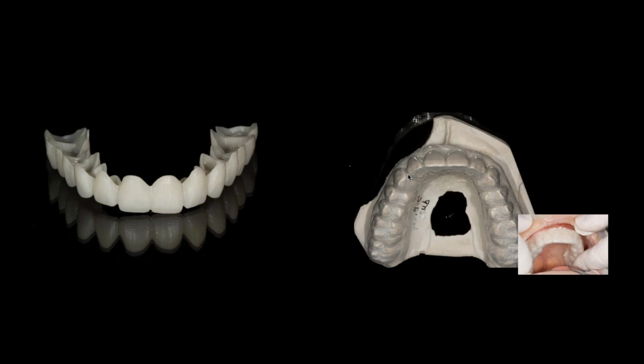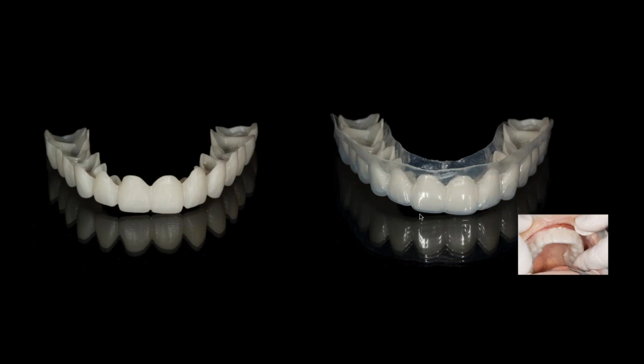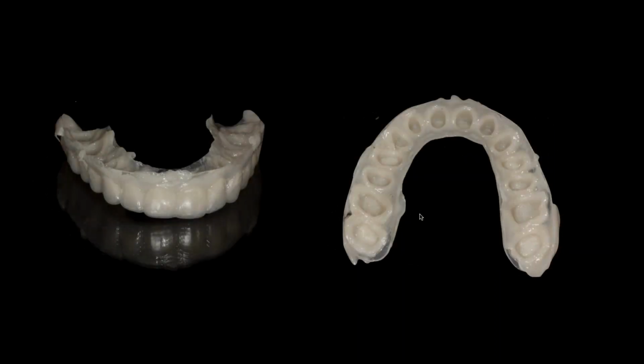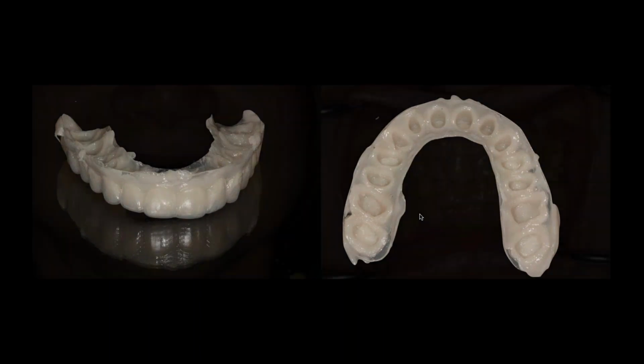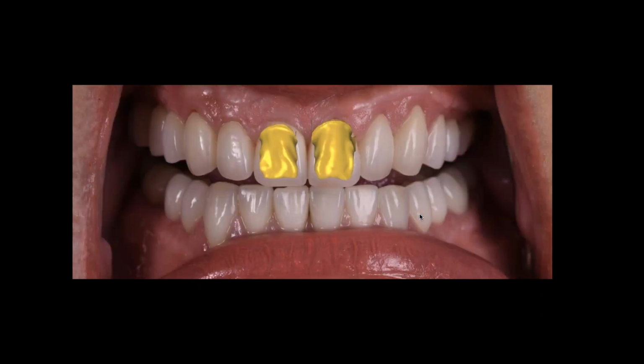The only one that really matters to me in the end is how do I bring it into oral? How do I get this into the mouth in the right plane? So we do that by actually printing out a version of this and then doing a suck down over the printout. That suck down then allows me to actually take the provisional into the suck down and we transfer it into the mouth that way so we can actually get the horizontal reference. Once we have those positions, we can actually go and put some bisacryl in to evaluate if our position is correct, and then we're going to go fabricate the final restorations.